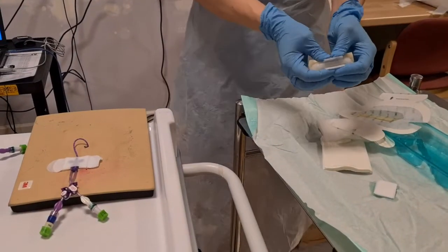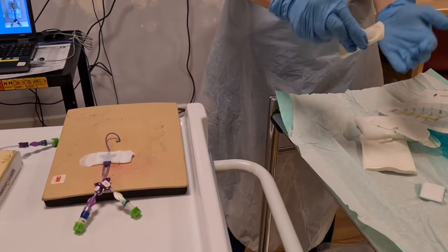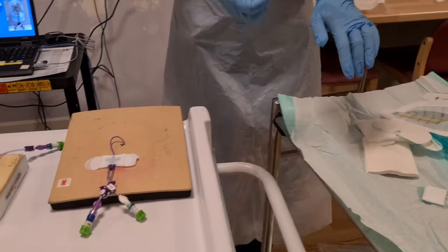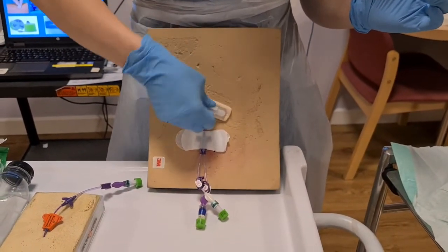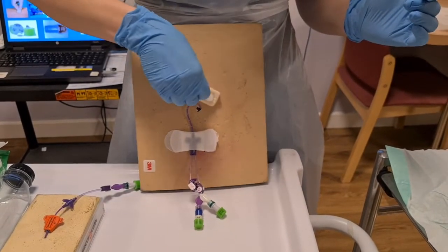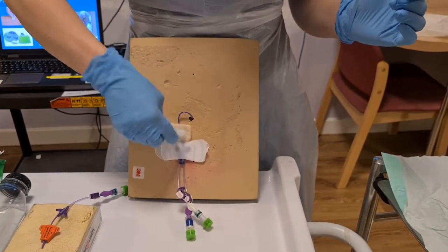What I do is use the ChloroPrep, moving it right down to the end of the foam, checking on your glove to make sure it's definitely through, and then go back to my patient. I'm going to go straight for my insertion site, just using different areas of the sponge all the way round, giving it a really good clean.